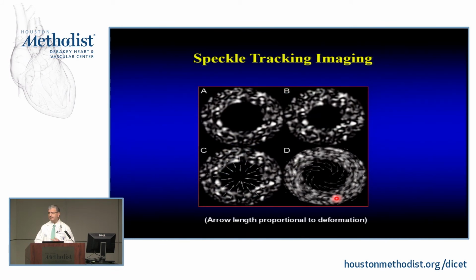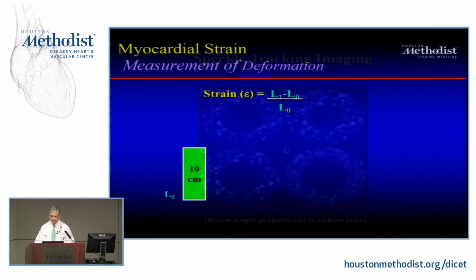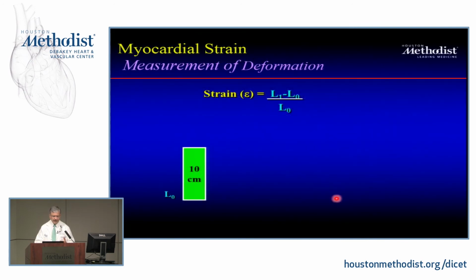Speckle tracking. Once I saw this abstract about 15 or 20 years ago, I said, this is it. There's no question about it. That's going to be a major change, because always your eye was trying to follow where the speckles are going in time. And having a technology that follows speckles, these speckles of refraction and reflection of ultrasound, is the way to go. Then you could track where the muscle is going, where the motion is going, be it leaflets or otherwise.